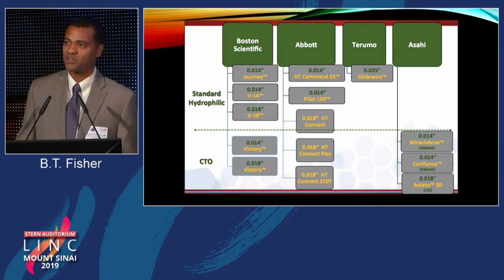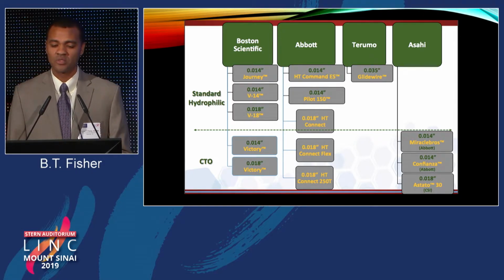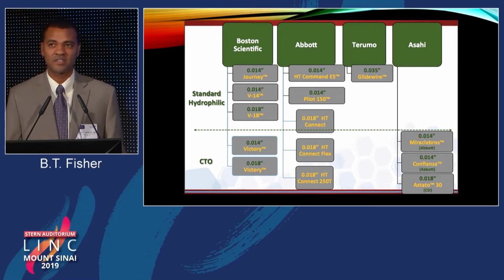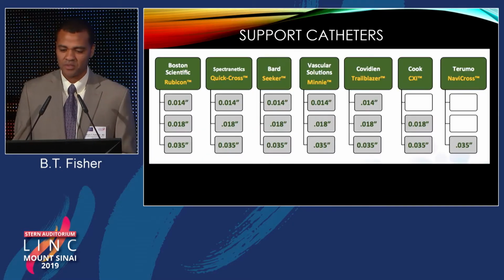Again, with the idea of getting through the cap and trying to stay within the true lumen, which my mentor, Dr. Mustafa, has really kind of perfected with the use of intravascular ultrasound. And most people don't have that advantage.